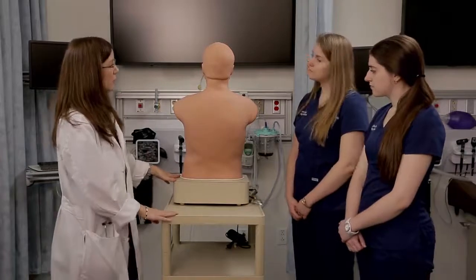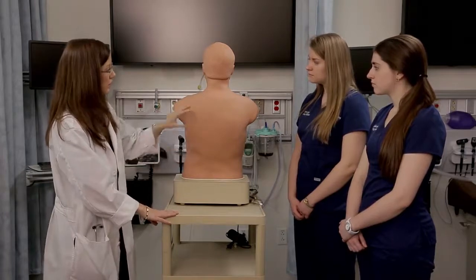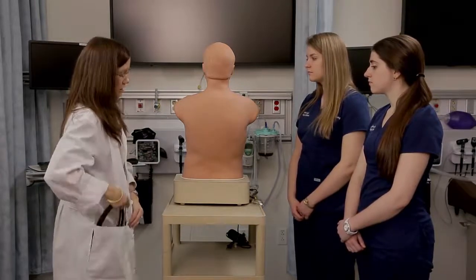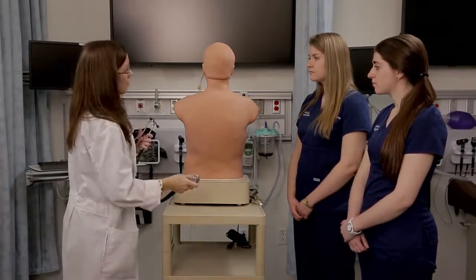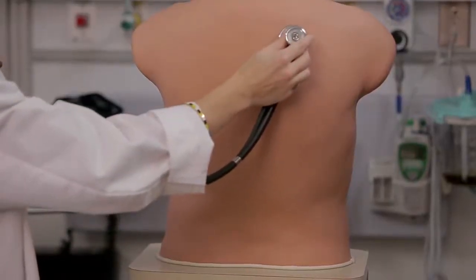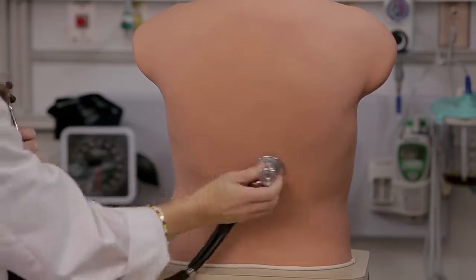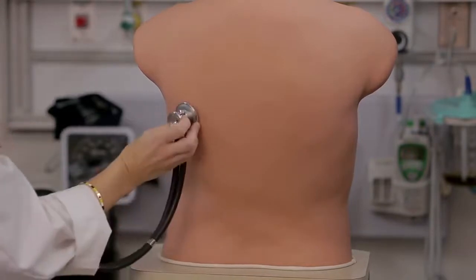So when a provider does an assessment of breathing, they're using their stethoscope to auscultate, or listen to the breath sounds. And you have someone take a deep breath as you move your stethoscope around the individual's posterior chest cavity. So just to demonstrate, in a very thorough assessment, you would listen in multiple locations. You would do somewhat like a ladder pattern: start here and move across, and then down and across, down and across, down and across, and then you would get some of the outer portions of the lungs as well.